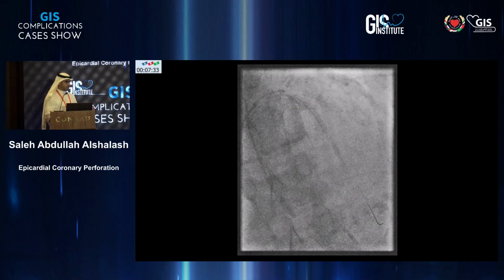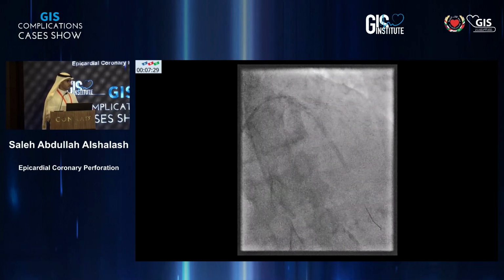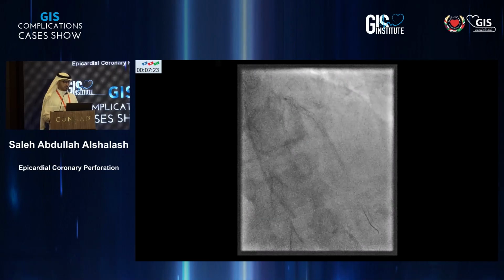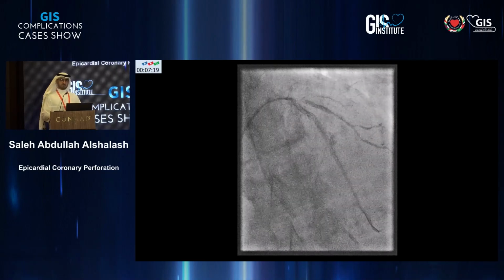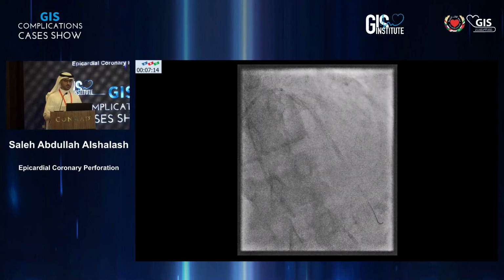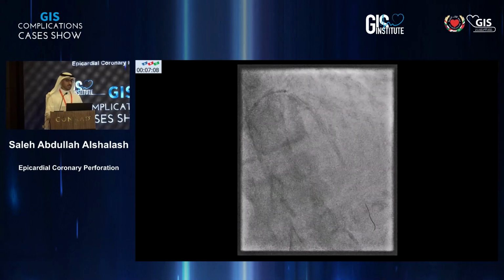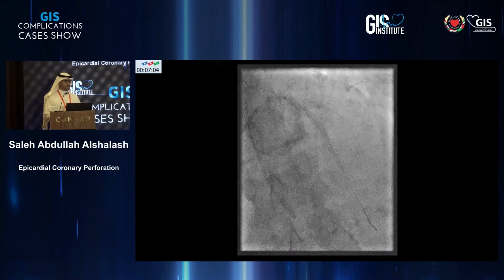Felt much longer, but the heart rate did not budge, the blood pressure did not budge. The patient was very peaceful and very calm and very happy, which I thought really does not make sense. I said, okay, 2 minutes and he's gonna crash. Echo machine arrives. I am focusing on bringing this defective, perforated balloon out, getting another balloon in, inflating the second balloon, and that took a while. We're opening a new balloon, etc.